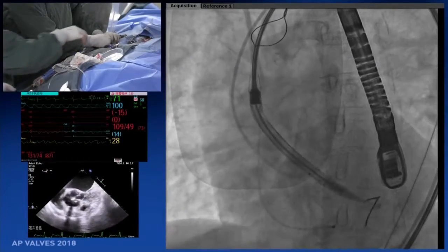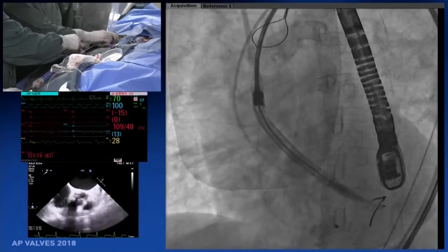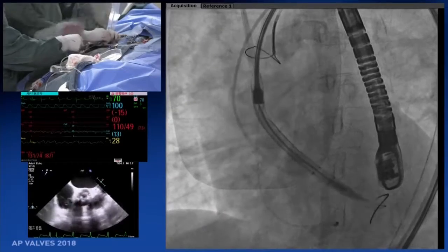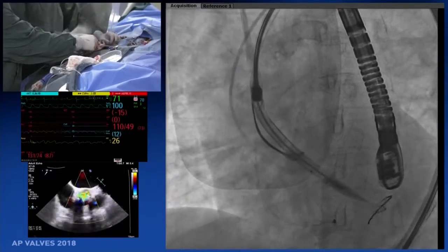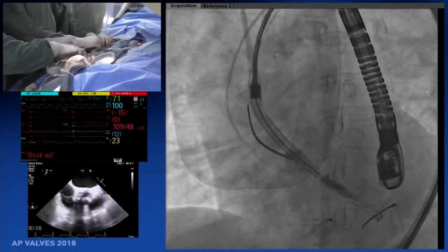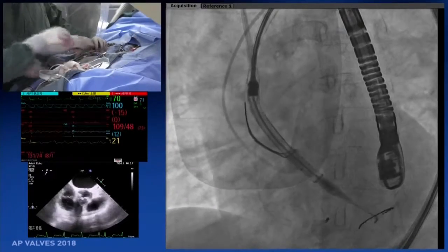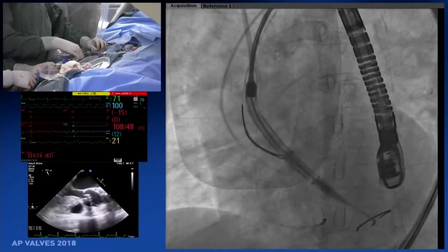Leave the snare at the tip of the delivery system, have tension there, and then pull the sheath back at the same time, and not too tight, so that you don't crimp it down. Actually, the snare can stay on the delivery system. Now pull a little bit. Maybe useful, but maybe not. You need to be able to pull on the tip. Eventually, this won't be at the tip.